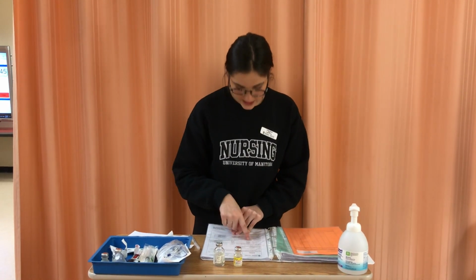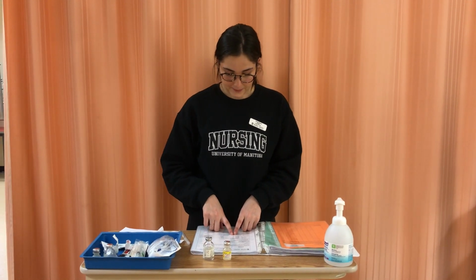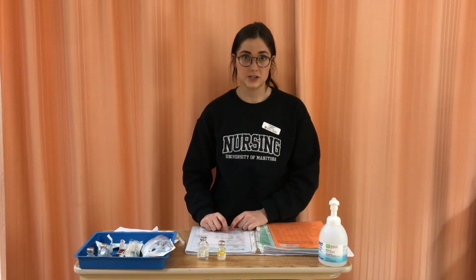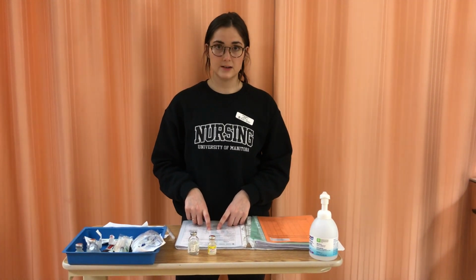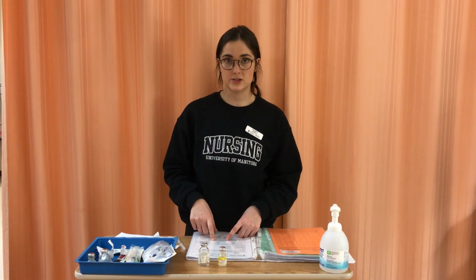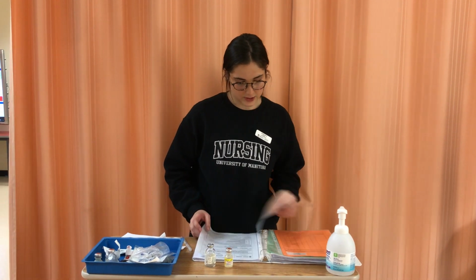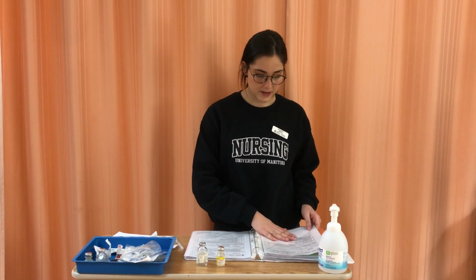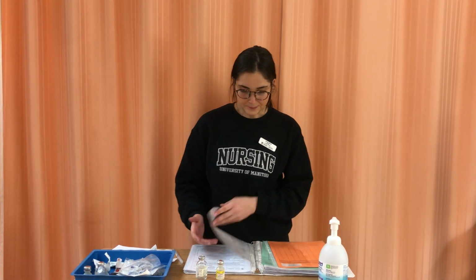So some other things, we're going to dilute this in 50 milliliters of normal saline, which we have right here. It says 50 to 100. The patient is not dehydrated, so that's why I'm giving them 50 of normal saline, because there's no nutritional indication for D5W at this time. And I'm going to administer this over 15 minutes. And so I'm also going to go over the side effects, so it's nausea, vomiting, diarrhea, headache. If they experience any of these, we'll monitor them.